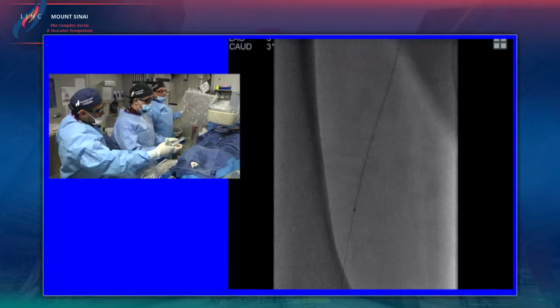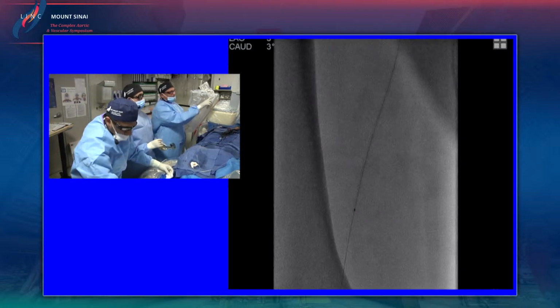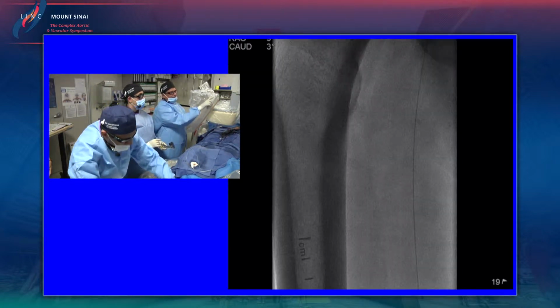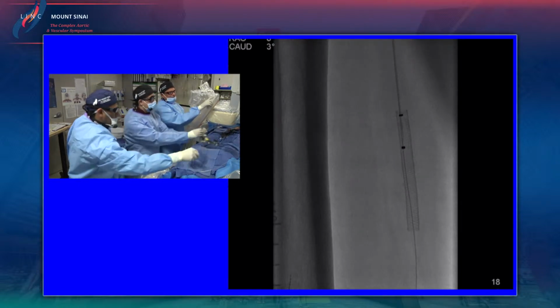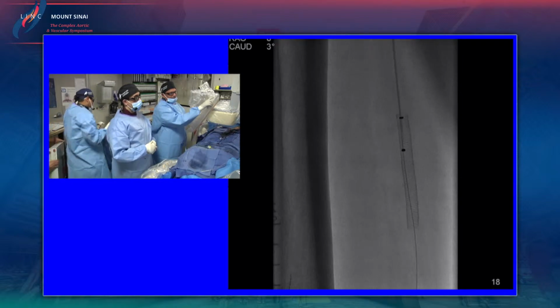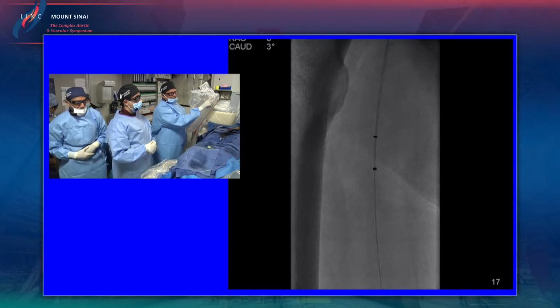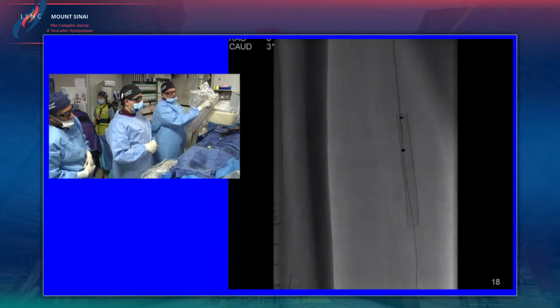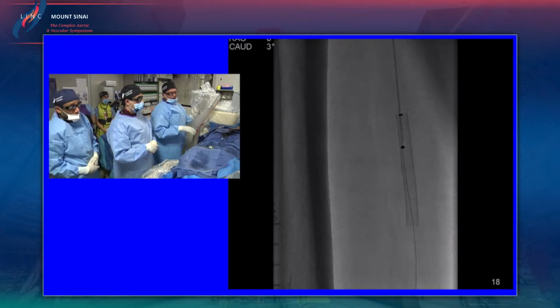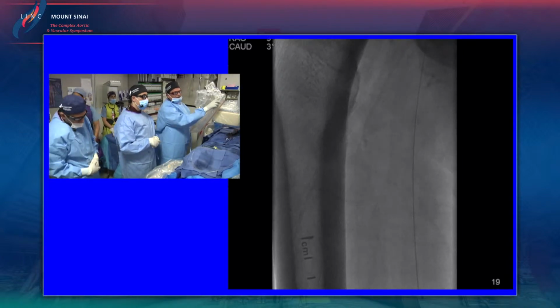So Giancarlo, I wanted to show you what we did. So at this stage, we went ahead and did an AngioJet. And as you can see, when we were doing the AngioJet, we were able to clean out the stent pretty good. The stent was full of clot here. And you can see as we were coming down at this area, there wasn't really much aspiration other than some clear substance. I think this is all in-stent restenosis. In this area, I believe there was a lot more thrombus, and we were able to really clean this area out. And then distally, you can see that it was much better.